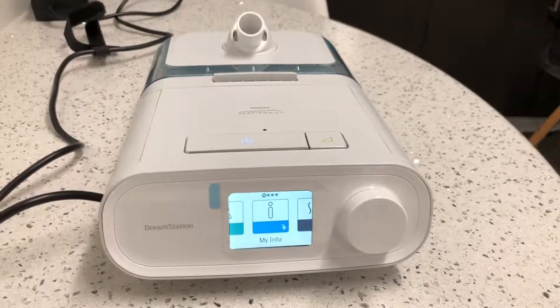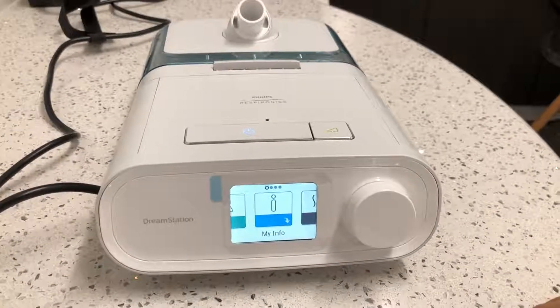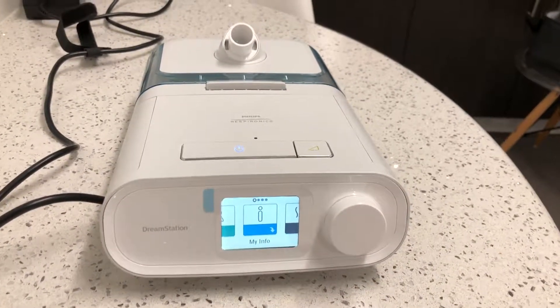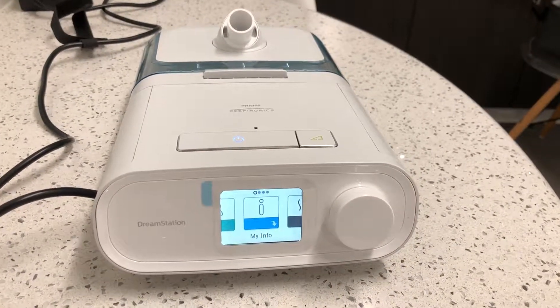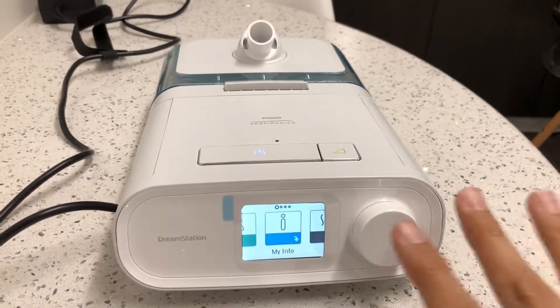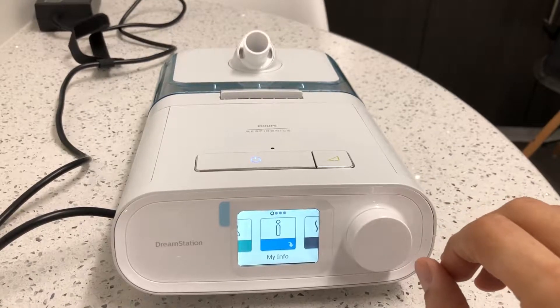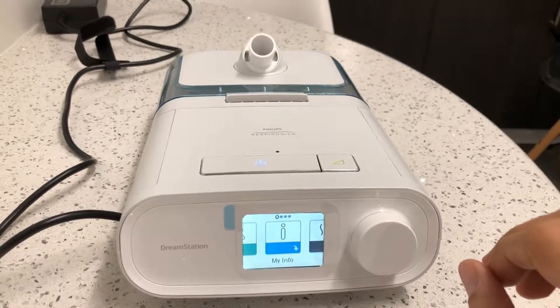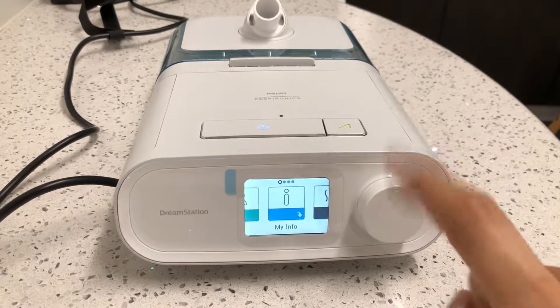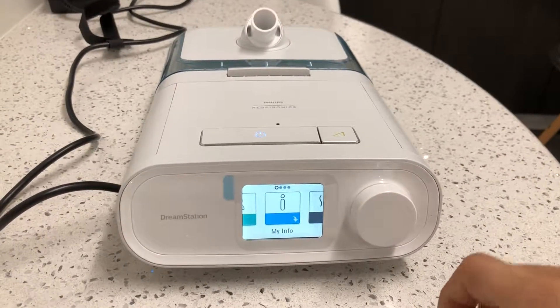Hi everyone, this is Dr. Jake Orsandy. I just want to make a quick video here to show you how to send a signal from your machine back to us. The reason we want to do this is from time to time we make changes to settings on the machine, and to get the changes within the same day you need to do one thing, which we'll show you right now.